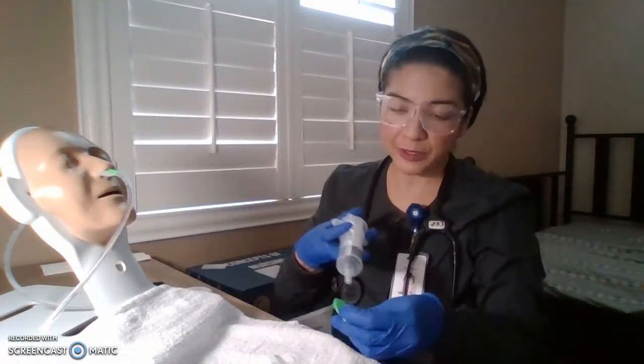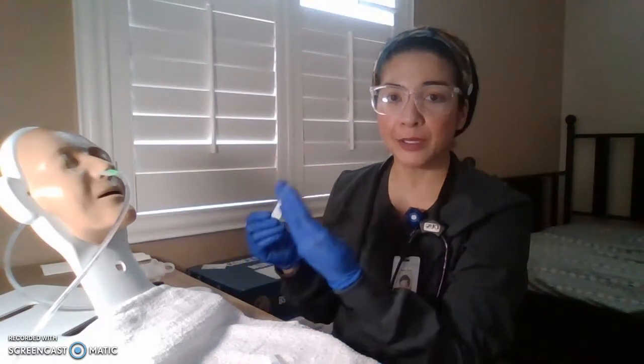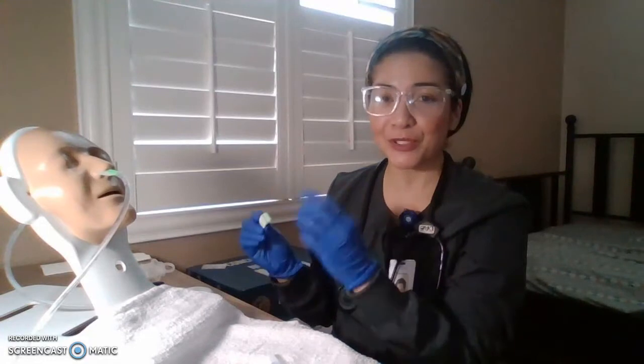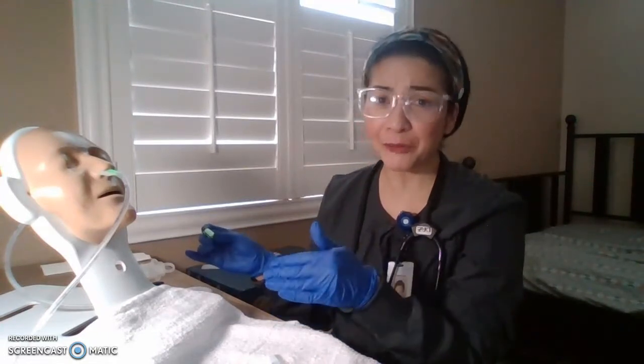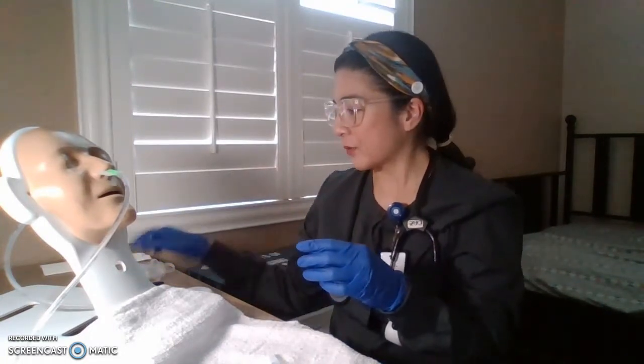And we're going to get our pH strip. Okay, and then we're just going to put one drop. And then we're going to wait, and we're going to compare. Usually it would turn green, meaning that you do have gastric content, but better to get that number, see that number 0 to 4, meaning you do have gastric contents. You're in the right place, having that gastric content if the level is 0 to 4 or below 5. Okay, so we've confirmed that.